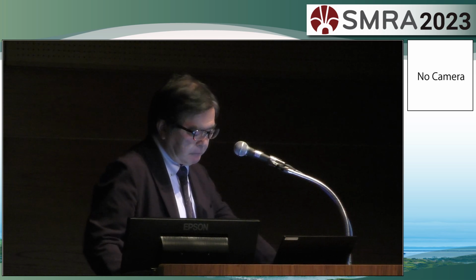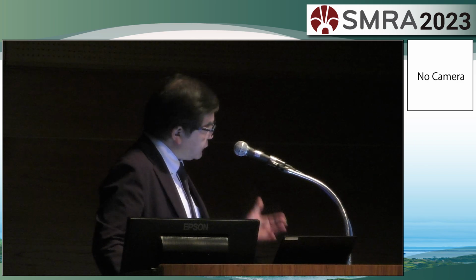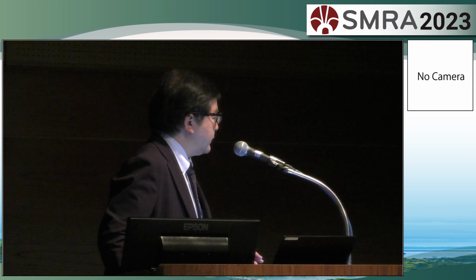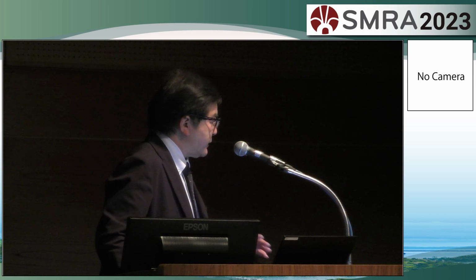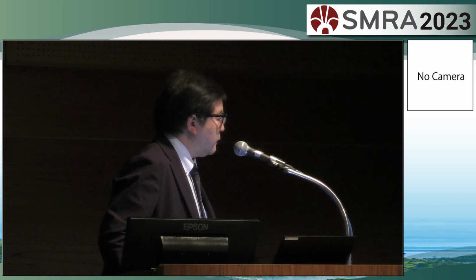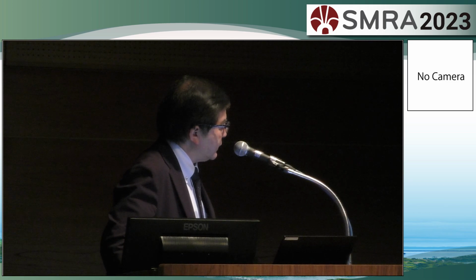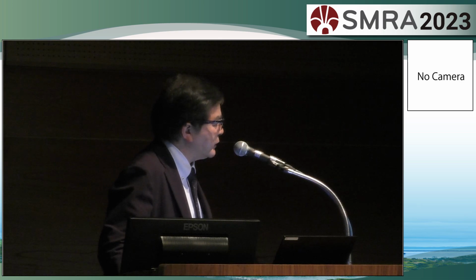For the 1.5T and 3T, in the Mie prefecture, many hospitals are doing similar CMR protocols. Basically, there's not much difference based on field strengths. Of course, the image quality of the coronary MRA is substantially different depending on the field strength. But for other studies, I think no problem.